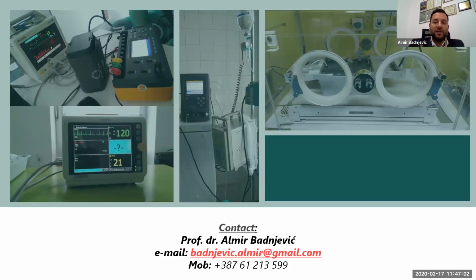So you are really measuring oxygen concentration. You are measuring, for example, the speed of it. You are measuring the volume. You are measuring the pressure, flow, etc., etc. But you are really measuring it. You are taking it outside the patient, you are connecting that outside device, you are connecting your mechanical ventilator to that device, and then you are in fact checking all of those values there.